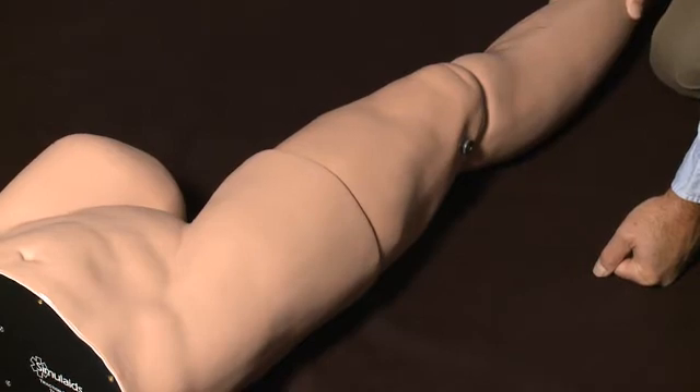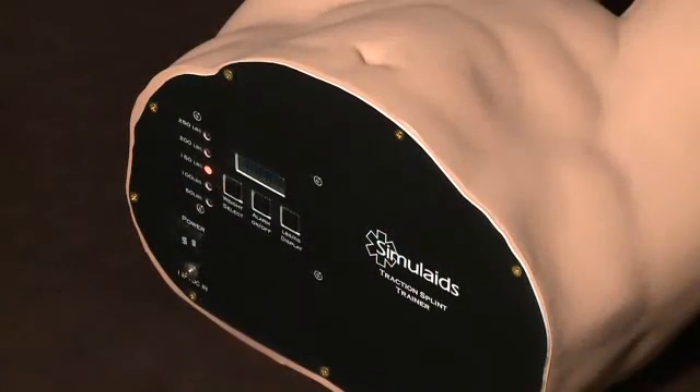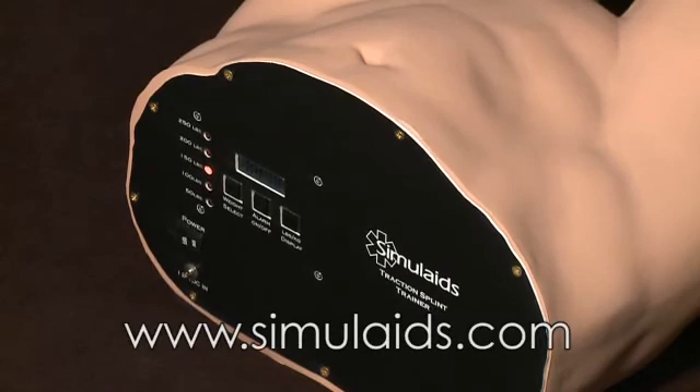You may use any traction device on the leg as far as a splint goes. That explains the Traction Trainer number 031 from Simulaids. You may find more information about it on our website, www.simulaids.com, or go to any of your local Simulaids distributors for more information and current pricing.